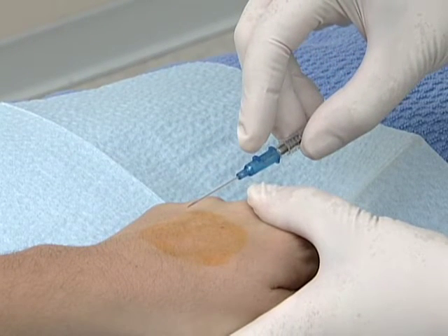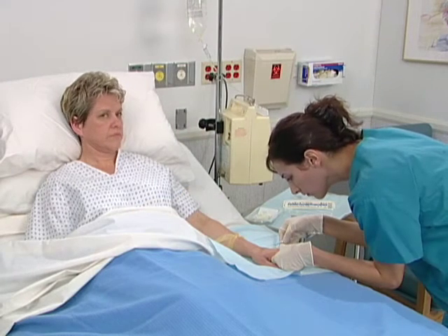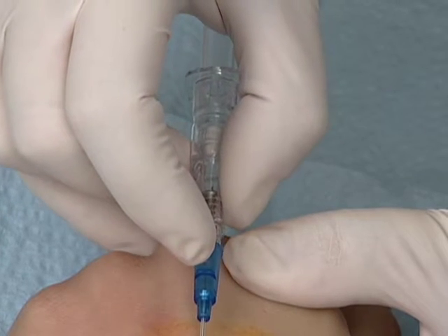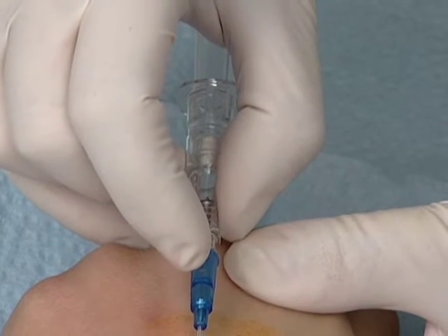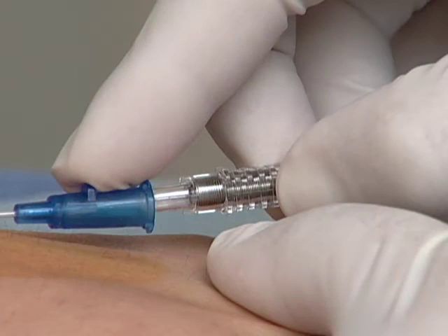The catheter remains in place for normal IV use. Vanishpoint catheters are available in a variety of sizes, each color-coded according to international standards to indicate the catheter gauge. Unlike other IV catheters, Vanishpoint IV catheters do not require additional components such as sliding sheaths, metal clips, or activation buttons.